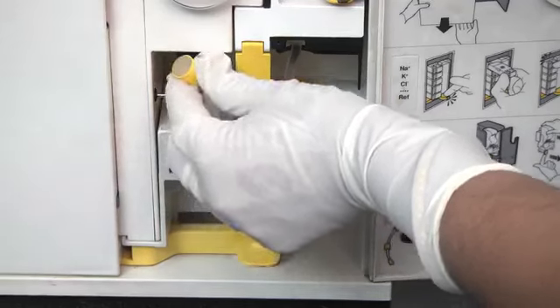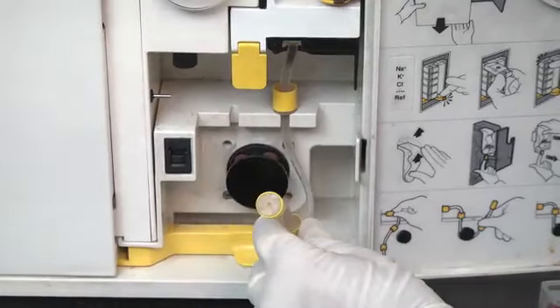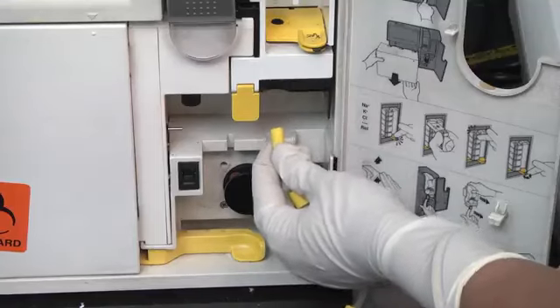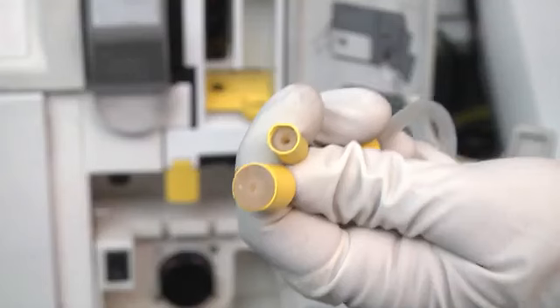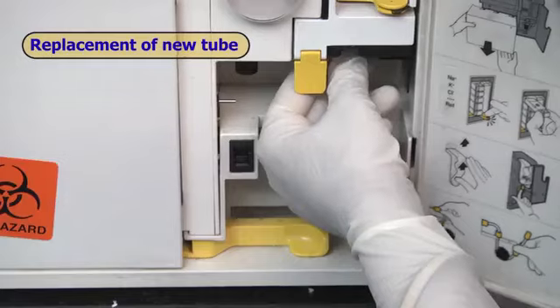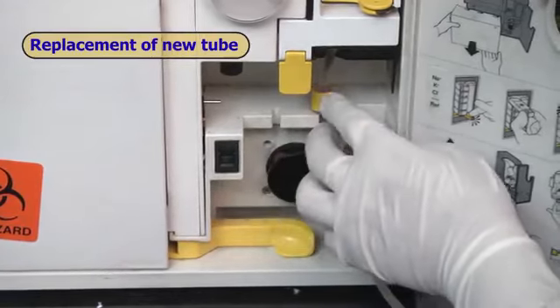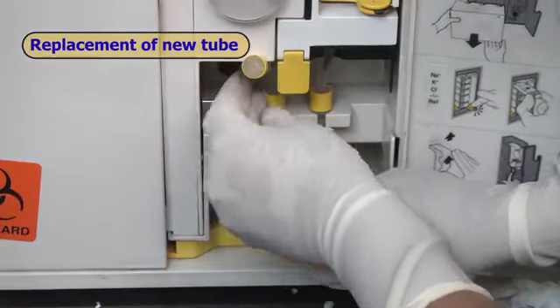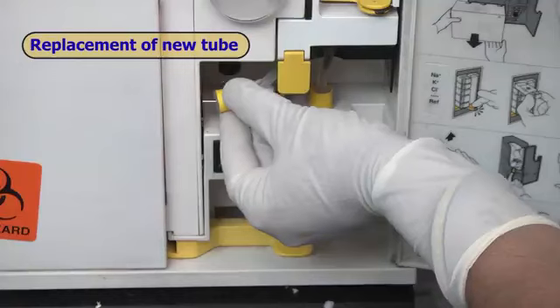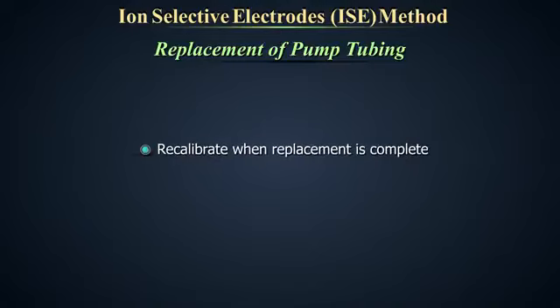Carefully remove the tube beginning from the collar on the left and then remove the tube from around the pump and then the collar on the right. The pump tube has a large collar on one end and a small collar on the other. Fix the large collar first, then fix it through the groove in the pump shelf. Bring it around the pump, then through the groove of the pump shelf again, and finally fix the small collar. Reagents will be automatically primed from the reagent module. It is necessary to recalibrate when replacement is complete.